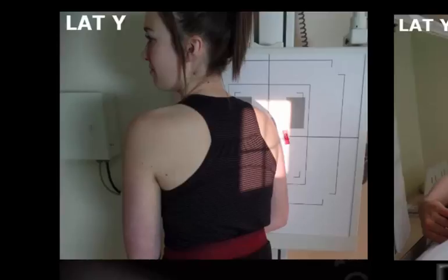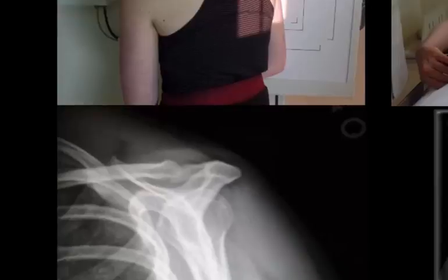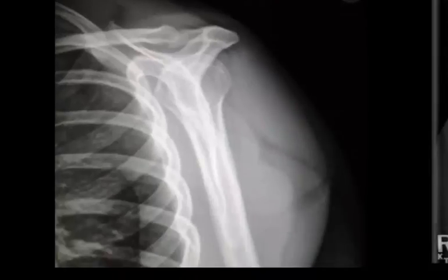And let's take a look at the image produced with a PA shoulder. Here we have a very nice Y defined by the coracoid and the acromion process, and notice that we have included the entire scapula all the way down to the inferior border. Also, you can see how that humerus goes right in line with the main body of the scapula.